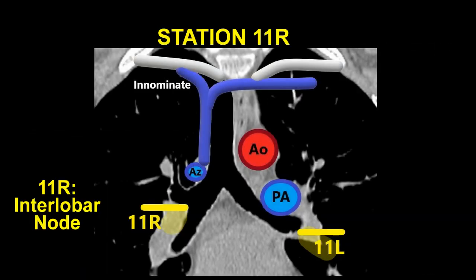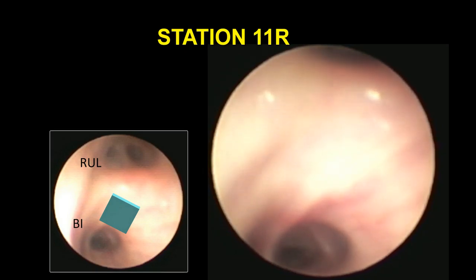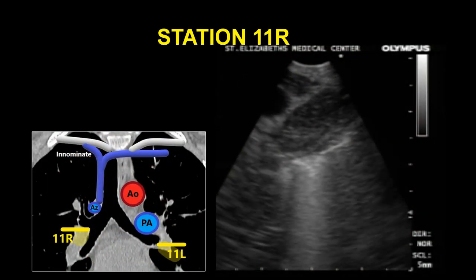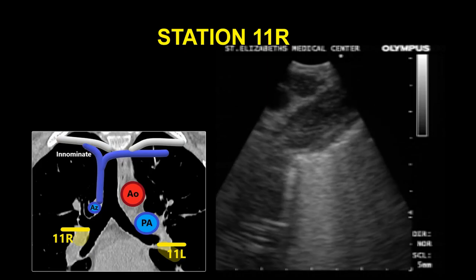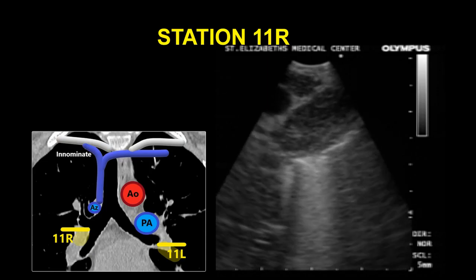Station 11R and 11L, the left and right interlobar lymph nodes, are those that are located between the origin of the lobar bronchi. Station 11R superior includes nodes located between the right upper lobe bronchus and the bronchus intermedius. To visualize this station, the EBUS scope can be moved to the proximal bronchus intermedius just below the secondary carina, with the probe oriented towards the right lateral wall, scanning the area between the 2 o'clock and 4 o'clock positions. The lymph node and interlobar artery at the 9 o'clock position can be seen.